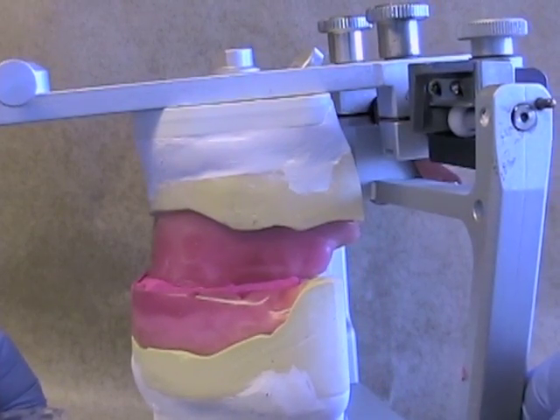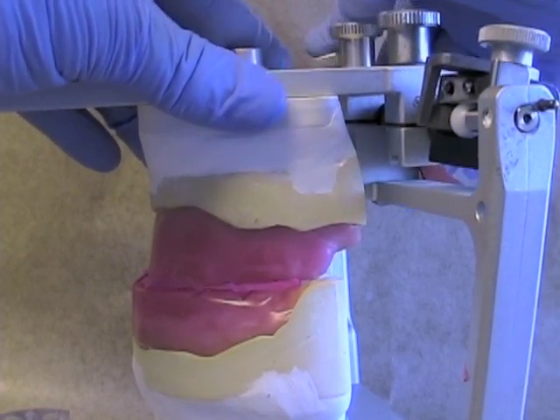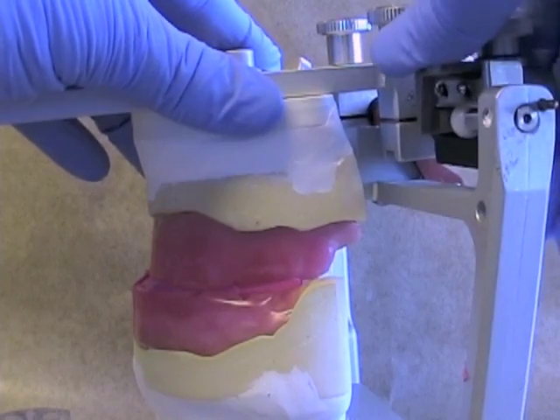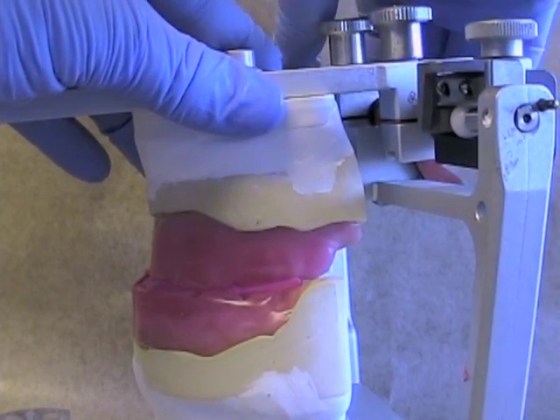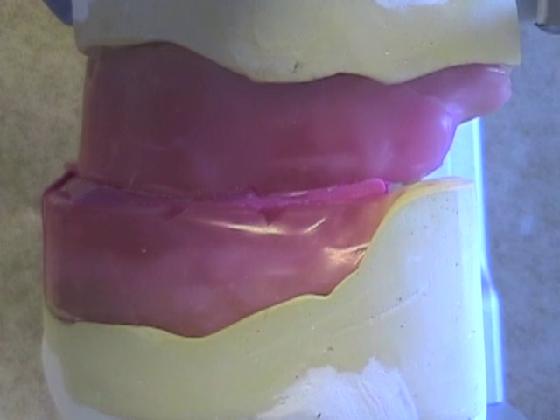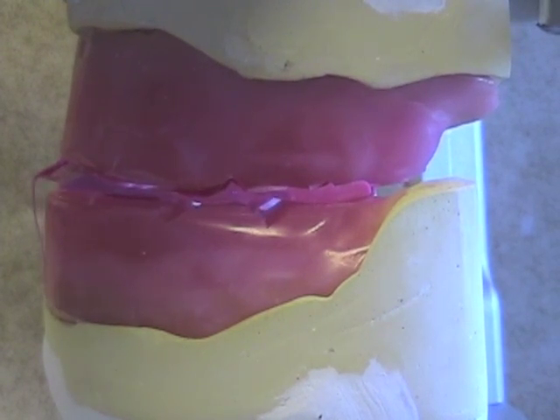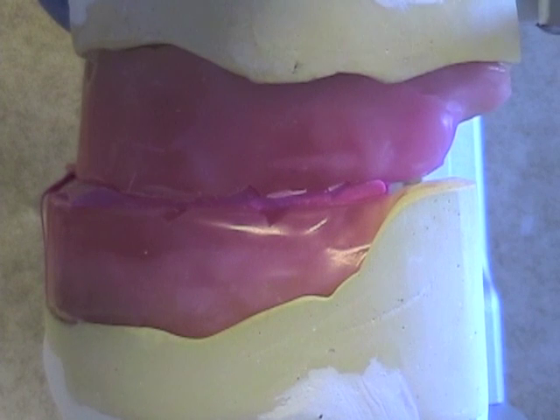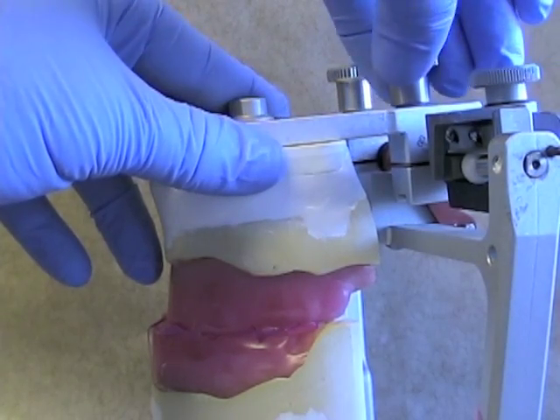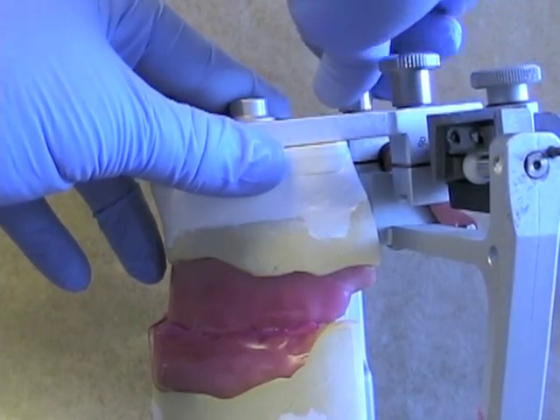To determine the condylar inclinations, seat the record between the maxillary and mandibular rims. Then rotate the condylar inclinations on both sides of the articulator until there are no gaps left between the rims and the record. You can see here as we wiggle it back and forth, we can eliminate all the gaps. Where we have maximal contact of the rim and the record, that's where we've got the inclination similar to what's in the patient's head. Once you've found the condylar inclinations that give maximal contact, lock the condylar guide and record the inclination.